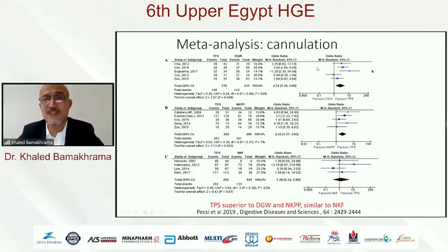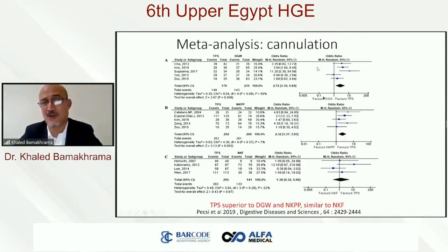Now, what is the difference between all these advanced techniques in terms of cannulation? If you compare transpancreatic sphincterotomy versus double guide wire, you can see there is superiority of the transpancreatic sphincterotomy.